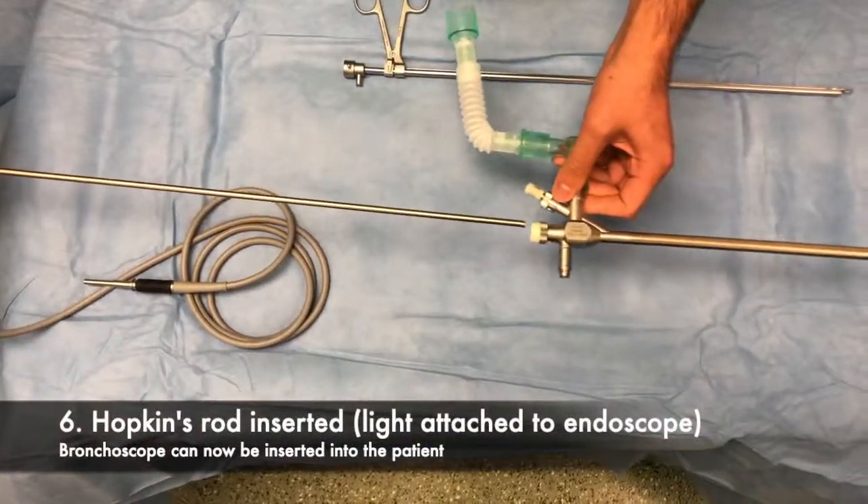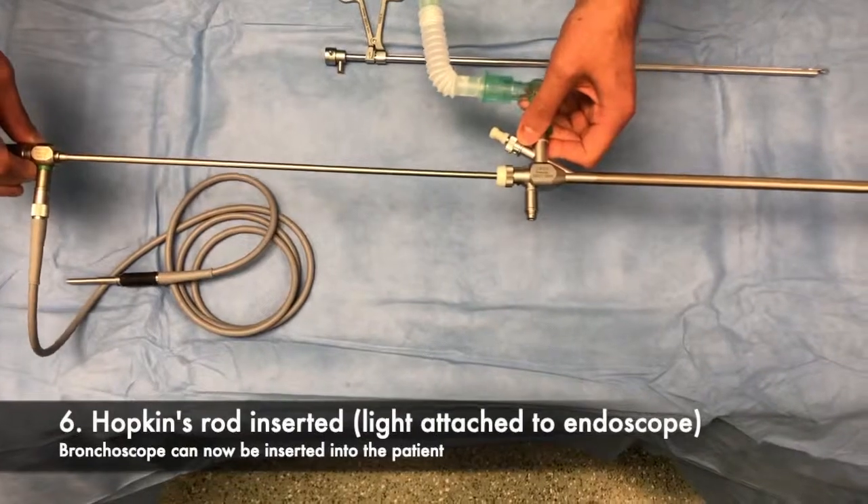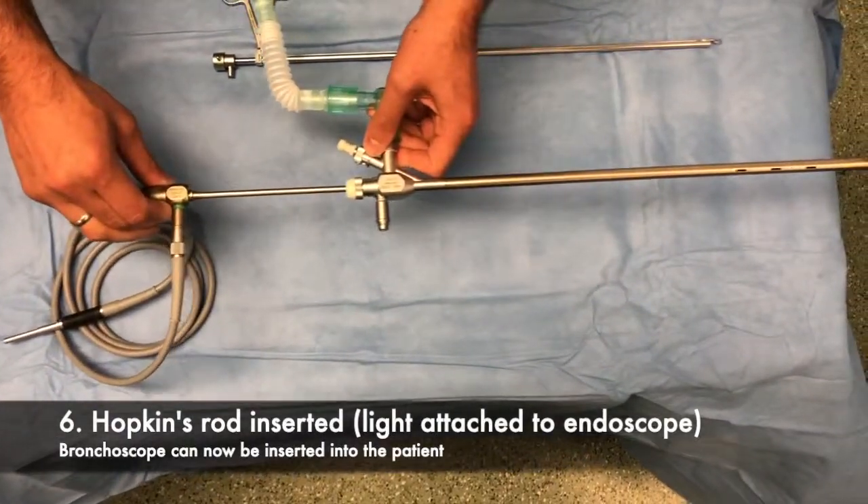The rubber telescope guide is assembled and then inserted over the central lumen of the bronchoscope as shown here. The Hopkins rod can then be inserted through this, and then the operator may insert the bronchoscope under direct vision or with a camera head attached.